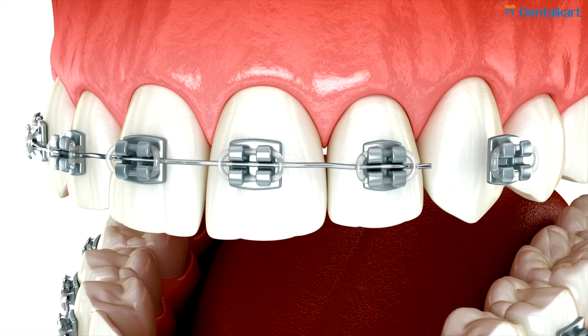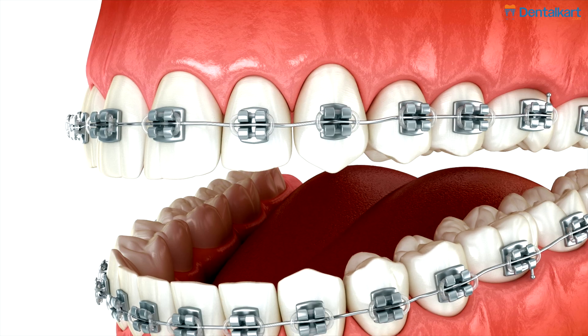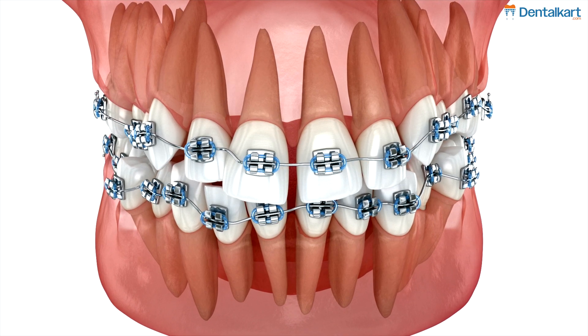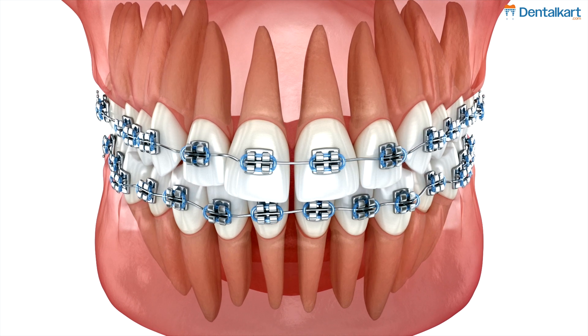Features of NiTi arch wires: Flexible and super elastic — provides gentle, continuous force for tooth movement. Shape memory — returns to its original shape even after deformation, ensuring consistent force application.